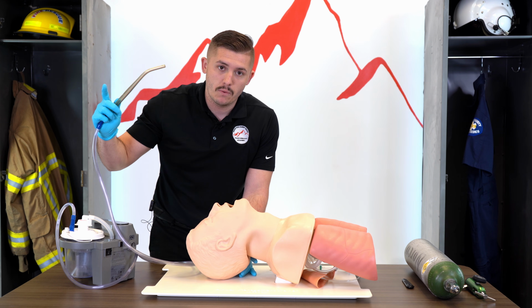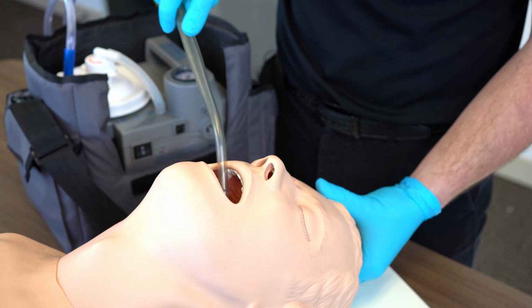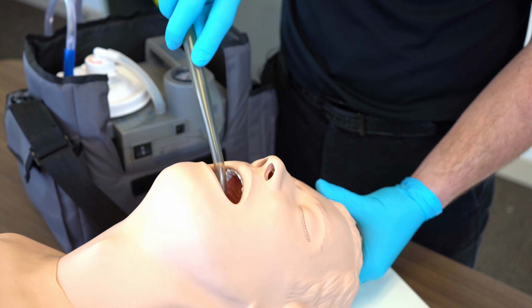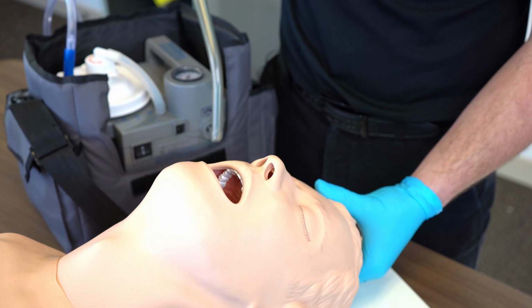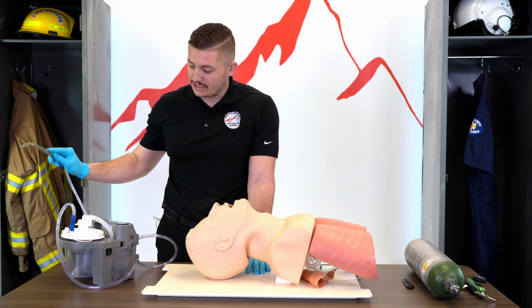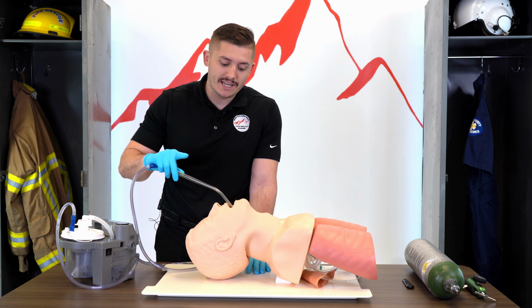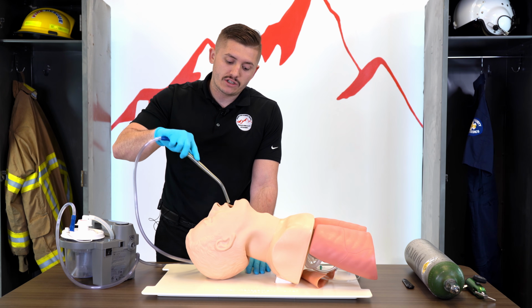I'm going to suction on the way out, okay? You can do a circular motion. You can do a zigzag. One thing we don't want to do is just sit here and hold it. We want to suction out because you might catch something on this, whereas you might need to actually come out of the airway, scrape it off, clean it off on a towel or something, and then go back in. So suction on the way out.